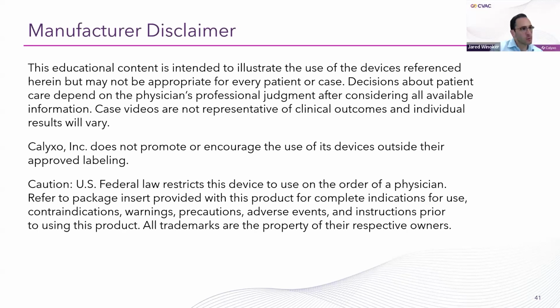Yeah, this is going to be one of those do as I say, not as I do situations where admittedly I did tackle a larger stone than I tend to recommend now. And thankfully it went well. But I think it's almost like that stone size that you'd almost think is maybe a little too small to even do this. But what we know is that stone free rates are soberingly low, even for the 8-9 millimeter stones. So you're still giving this patient an effective treatment that's potentially sparing them long-term complications from residual stones.